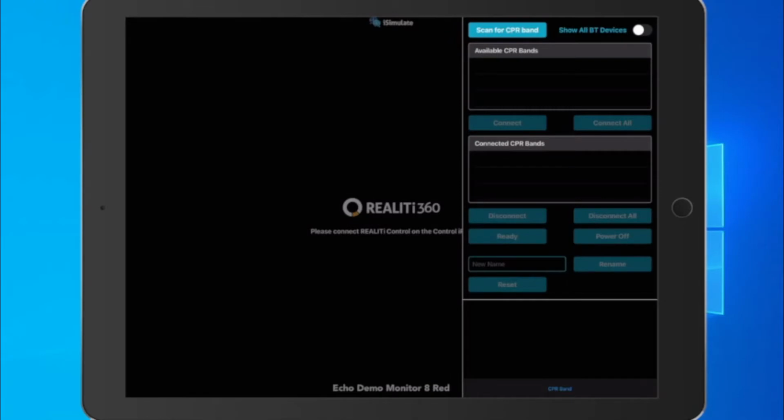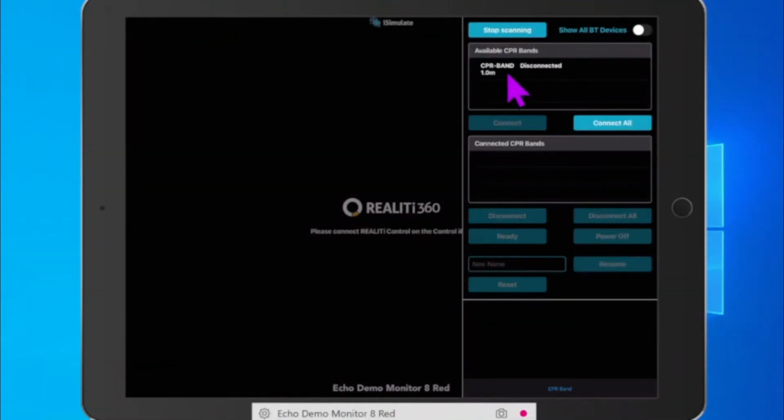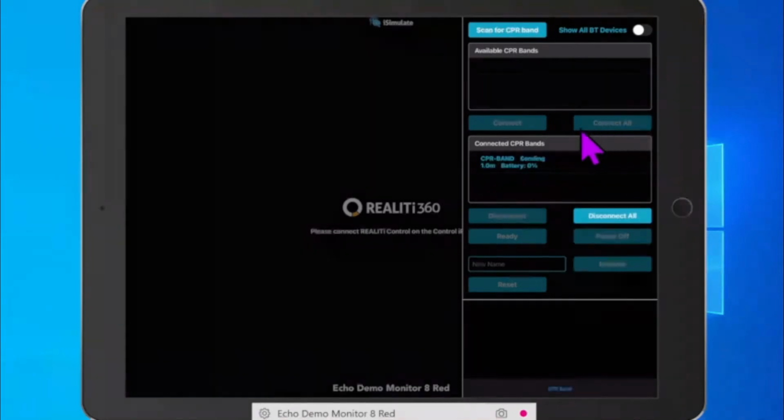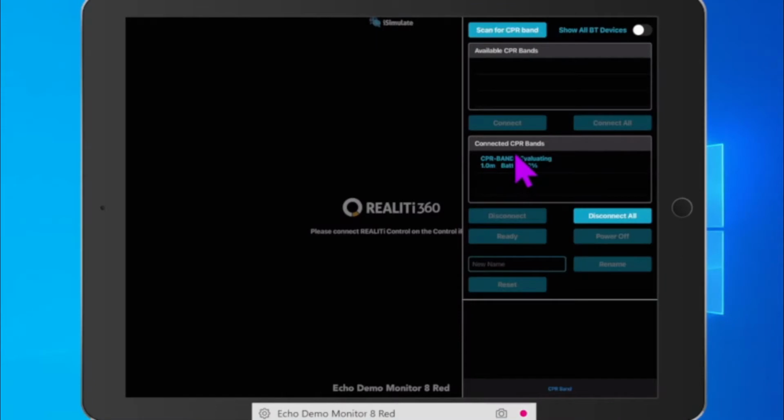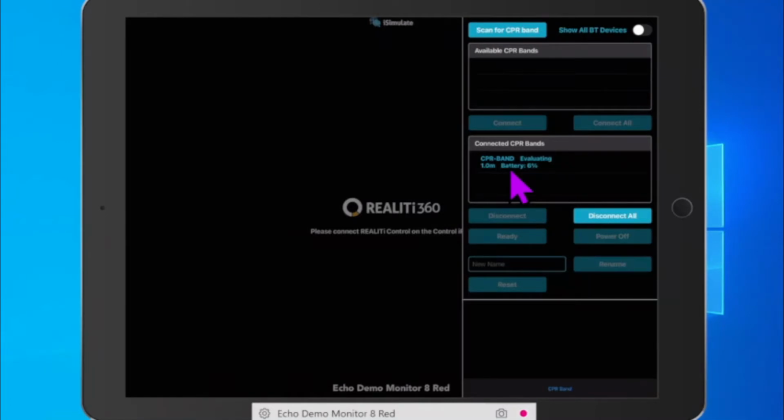I want to go up to where it says scan for CPR band. I'm going to touch it and click on it. It's going to show that I have a CPR band that is disconnected. I'm going to connect all. And now it's going to show that my band is connected. And here's where it tells you your battery levels. Right now it's saying that I have a low battery level on my module at 6%, so I'll probably need to plug that in very soon.